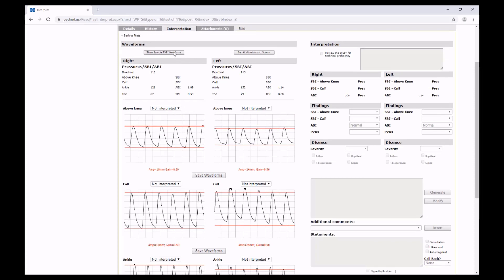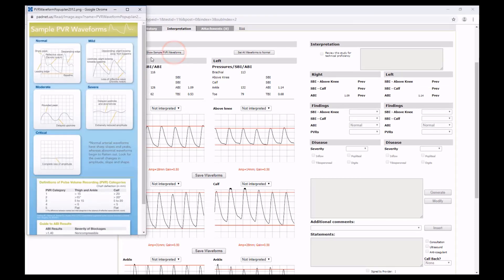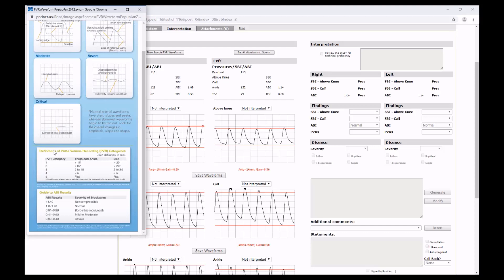When interpreting your results, we have a Show Sample PVR waveforms, which gives you a metric, showing the shape of normal PVRs all the way to critical PVRs, as well as ways of rating the amplitude in the thigh and ankle and the calf, and a guide to interpreting ABIs.